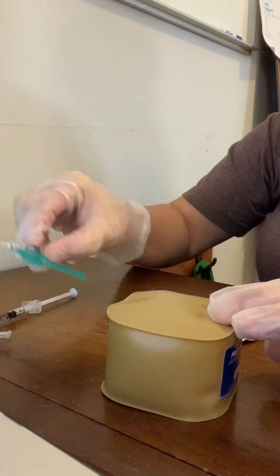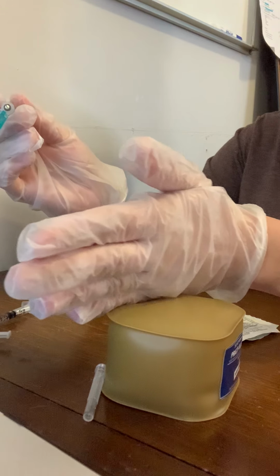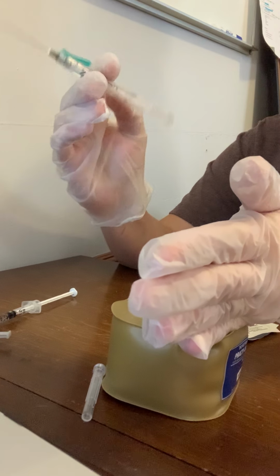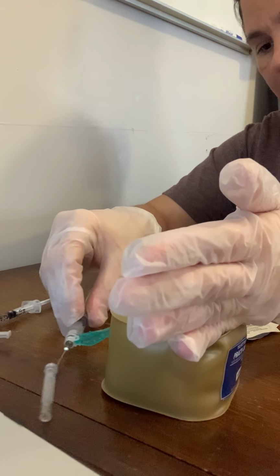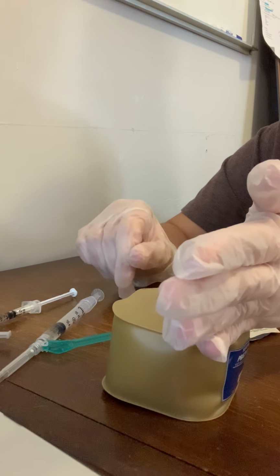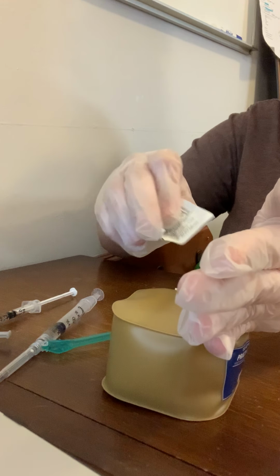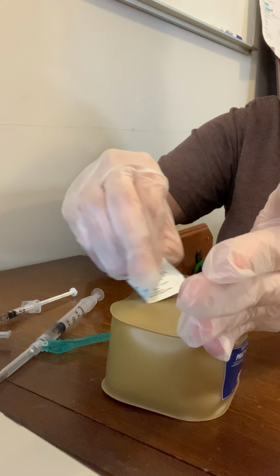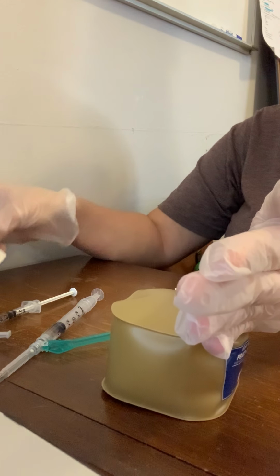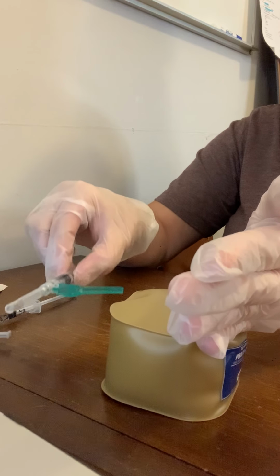I will remove my needle cap. I'm going to pull the skin. Oh, hold on, I don't want to do that yet. I'm going to pull the skin taut for a Z-track method. I will cleanse the site from the center outward, let that air dry, and then I will remove my needle cap.